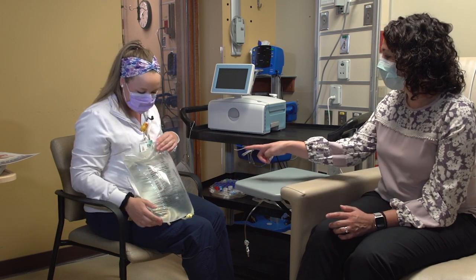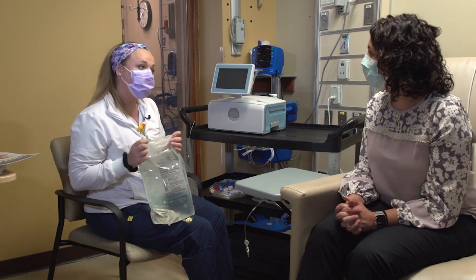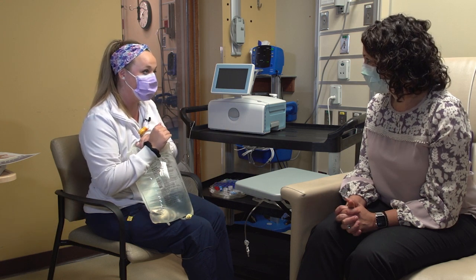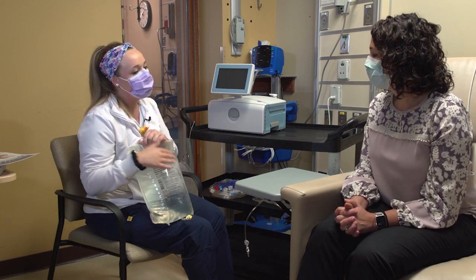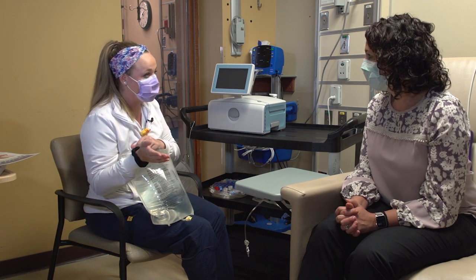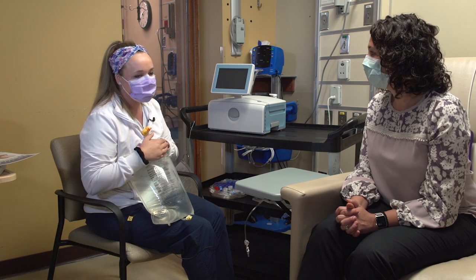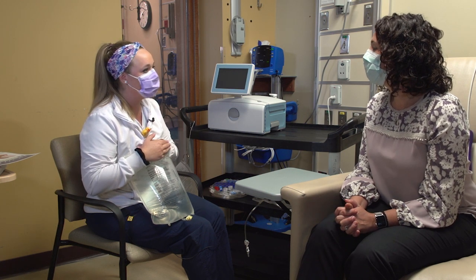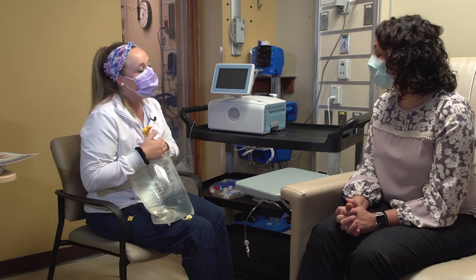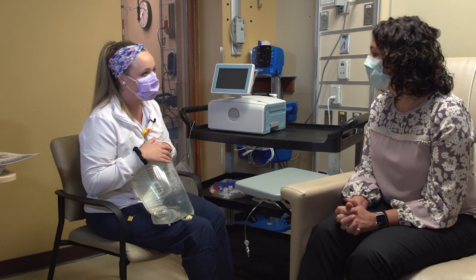So all of that fluid would go in my tummy? Actually, not all of it. During the cycles that your provider prescribes for you, they'll let you know how much fluid you'll need for your treatment. So basically, most of the time, I think our patients go between 1,500 milliliters and 2,000 milliliters on average, but it always depends on the patient.